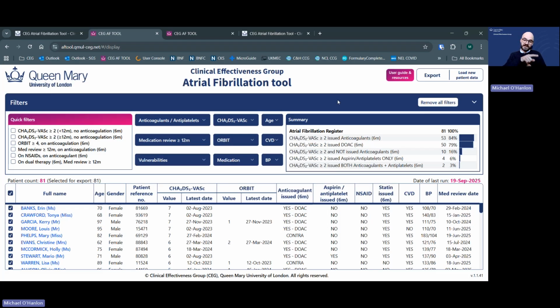So you can click that link to launch the tool, and then you could actually completely disconnect your laptop from the internet. You can unplug it, turn the Wi-Fi off, whatever. You can still import your file and run the tool completely fine, even with your internet completely unplugged. Okay, so no processing of patient data is happening on our systems. Your patient data remains on your system at all times. So just a quick overview to give some reassurance around information governance. If anyone has any further questions, then please do just pop them in the chat.